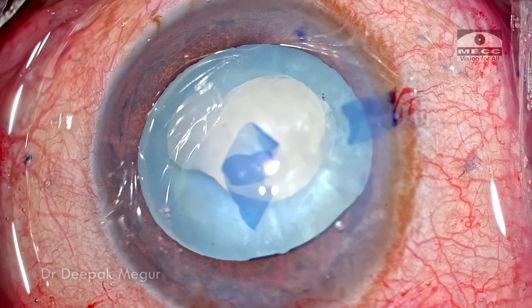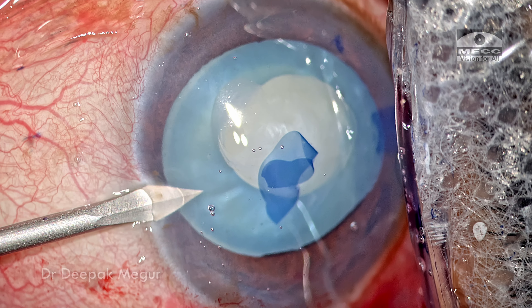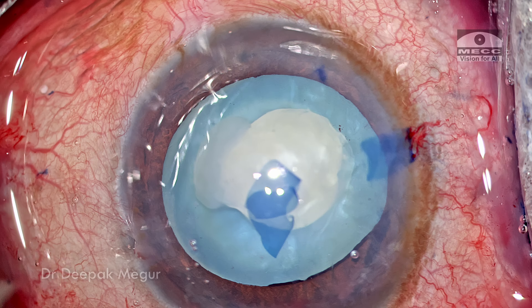I now have a smaller primary rhexis. It's slightly eccentric but not an issue at all — it will be corrected during the secondary rhexis.